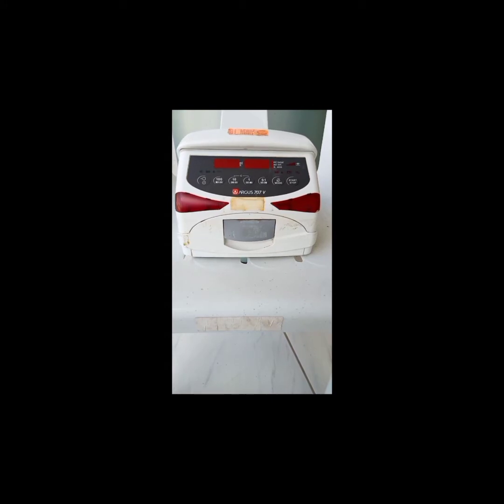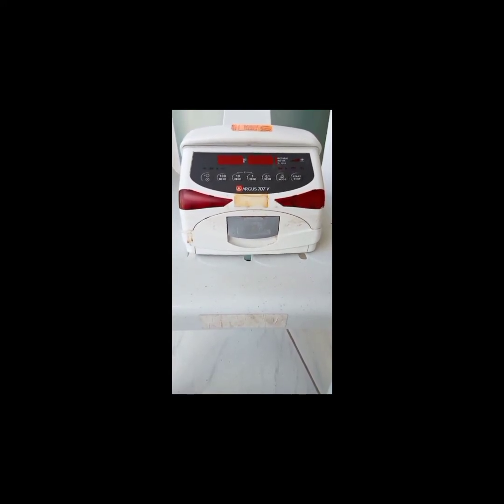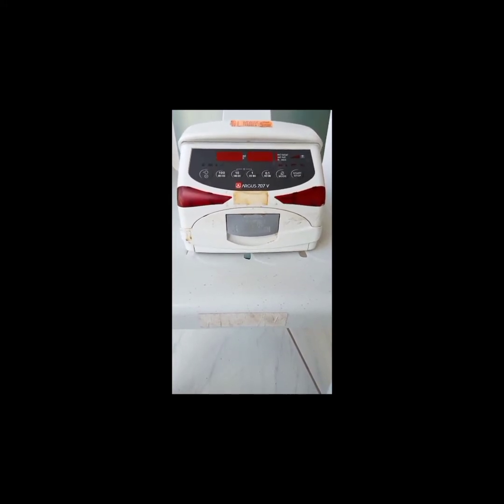It is the Argus 707 V. And the problem with this one is it does alarm a battery empty or doesn't have power. And we're going to check this up and see what's inside. And let's open up.